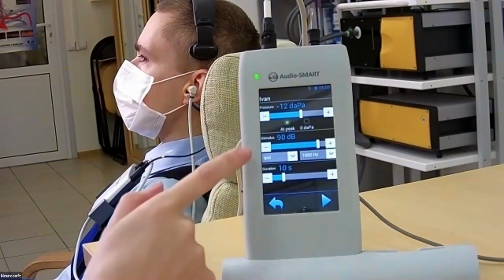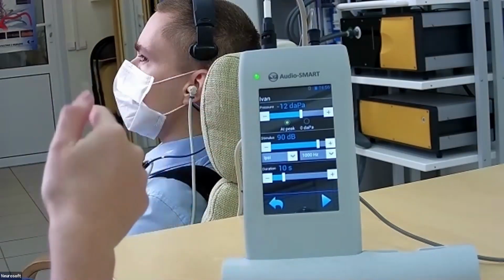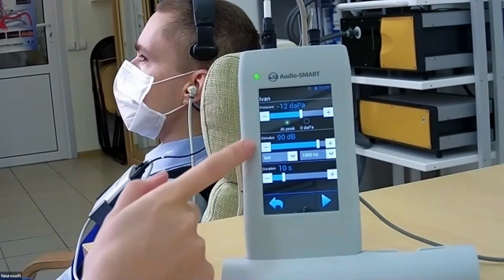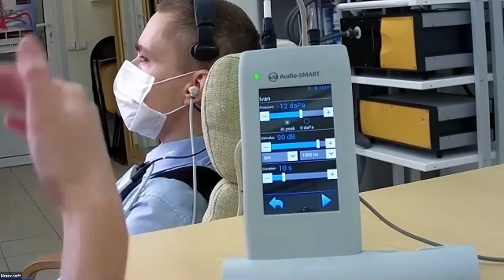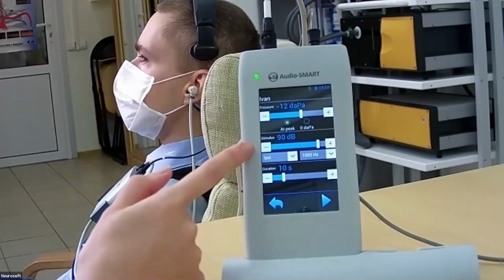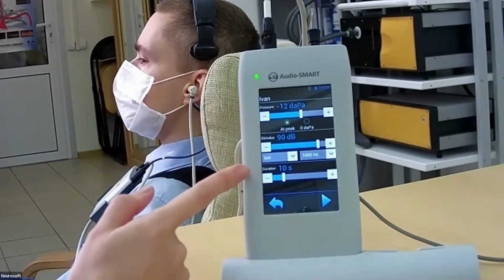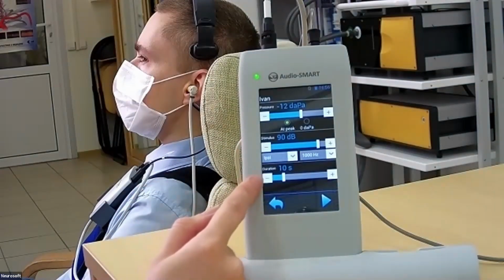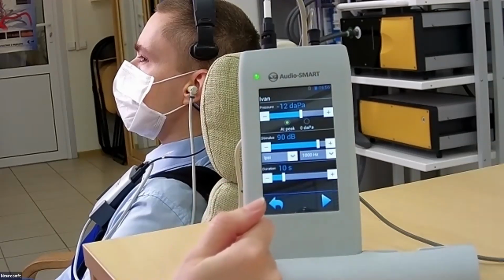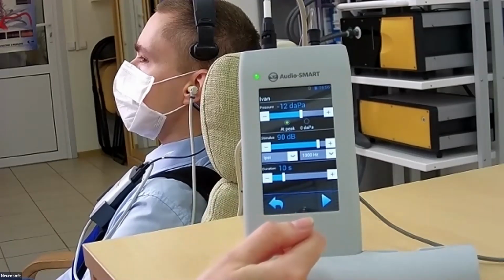I see the pressure peak which came from the tympanometry of Michael, and the stimulus will be 90 dBs. It's higher than the acoustic reflex threshold on this frequency. I can change it before testing will start, and the duration by default is 10 seconds. I also can change the frequency if I need, but mostly in routine practice, 1000 Hertz is used.